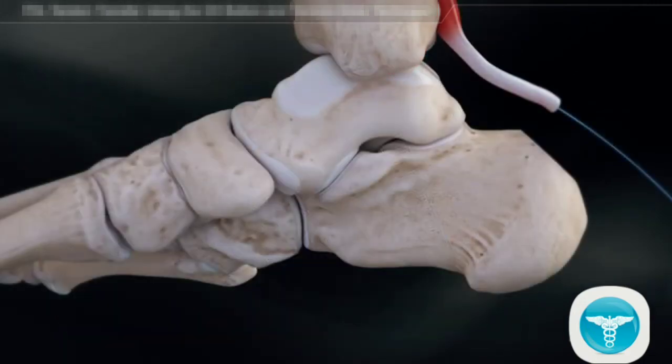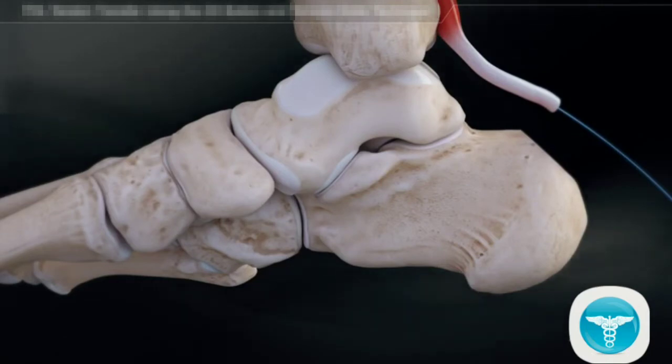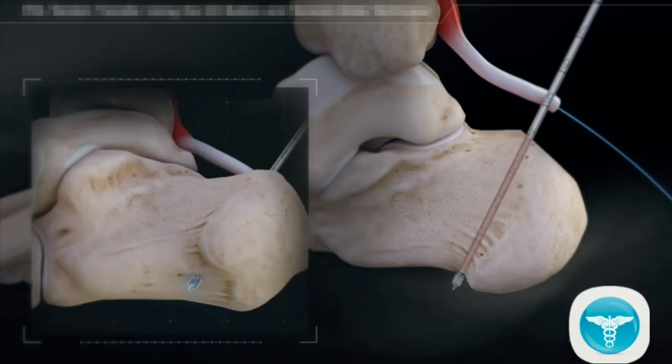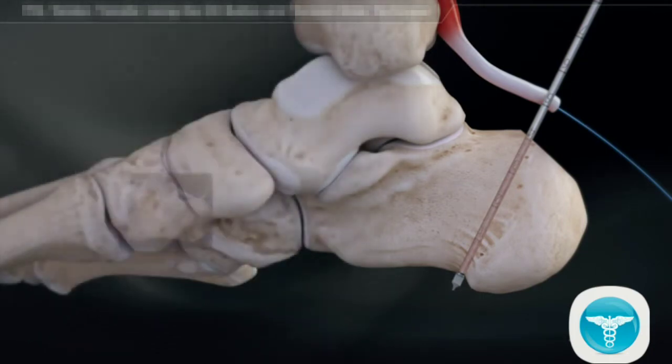On the superior calcaneus, approximately 1 cm anterior to the Achilles insertion, drill the 3.2 mm spade tip drill pin bicortical, aiming 1 cm anterior to exit the plantar surface in the midline of the calcaneus and centered medial to lateral. Note, fluoroscopy is recommended to ensure the 3.2 spade tip pin just breaches the plantar cortex. It is important to make sure the drill does not exit along the plantar posterior tuberosity.